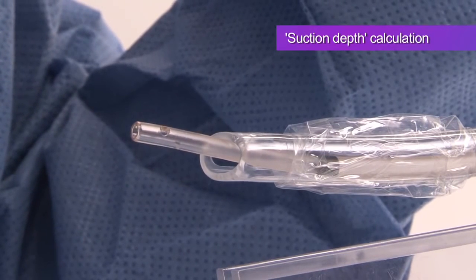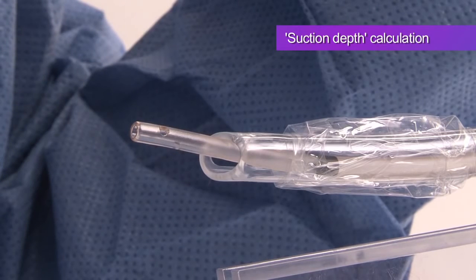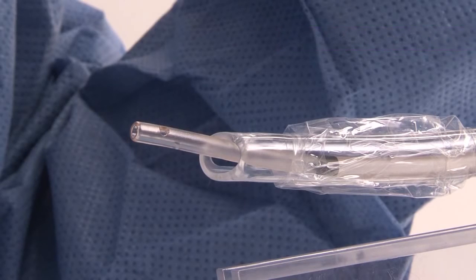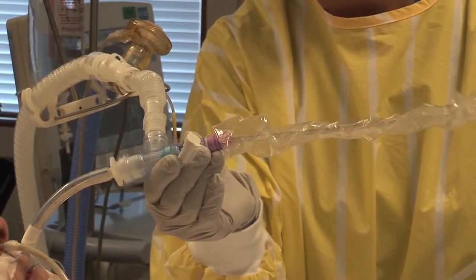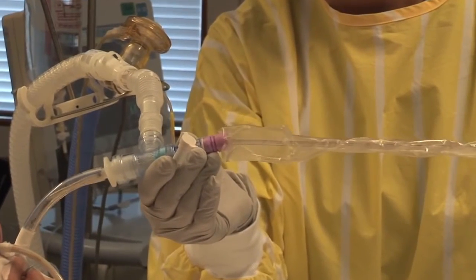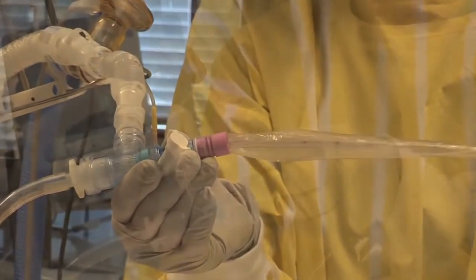Bear in mind that controlled depth suction procedures for neonates, 24-hour track care and 72-hour track care are all slightly different. Once the suctioning has been completed, you should carry out a normal suction pass to clear loosened secretions.